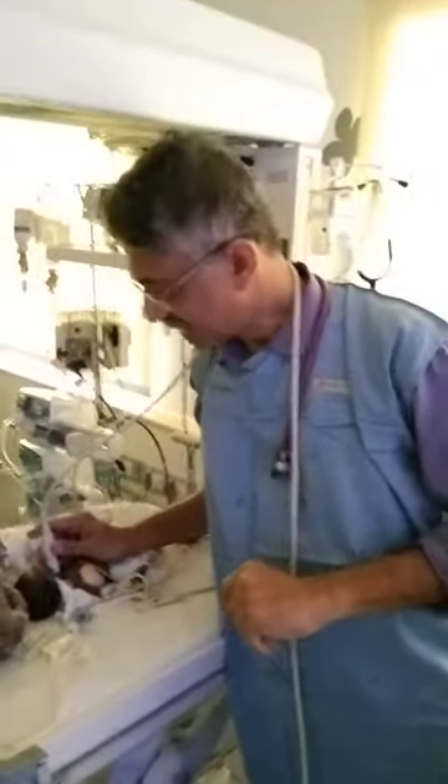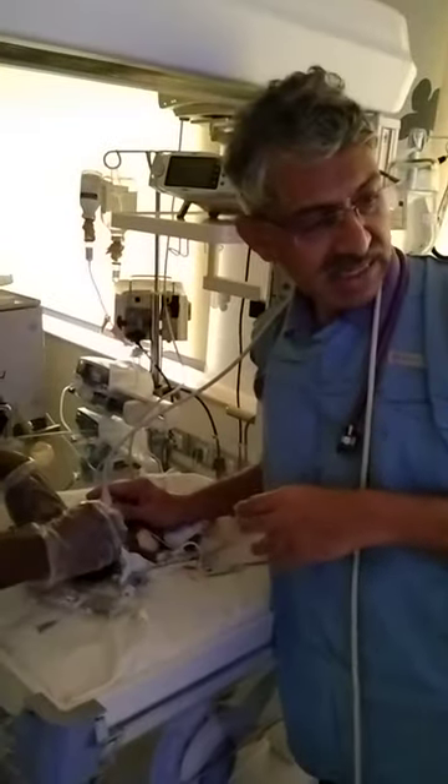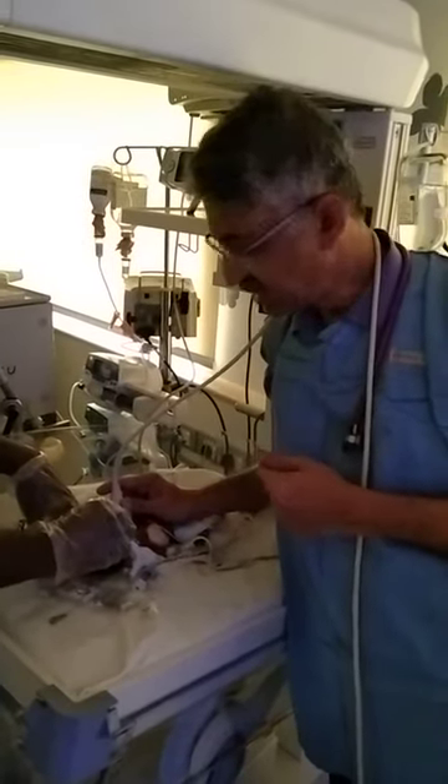Hi, I am Dr. Venkate from the Consultant of Neurology. My friend fellow has intubated a child and wants to confirm whether the tube is in the trachea or in the esophagus, and it is a difficult intubation.